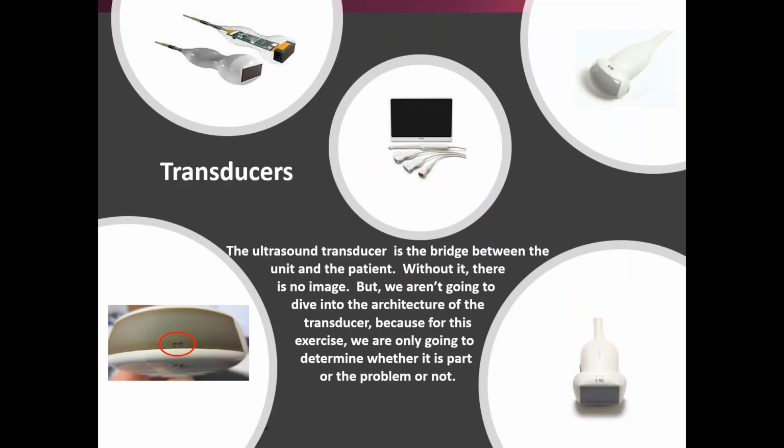One of the most vital pieces of equipment where image formation is concerned would be the transducer itself. The ultrasound transducer is the bridge between the unit and the patient. Without it, there is no image at all. But we aren't going to dive into the architecture of the transducer because for this exercise, we're only going to determine whether it's part of the problem or not.